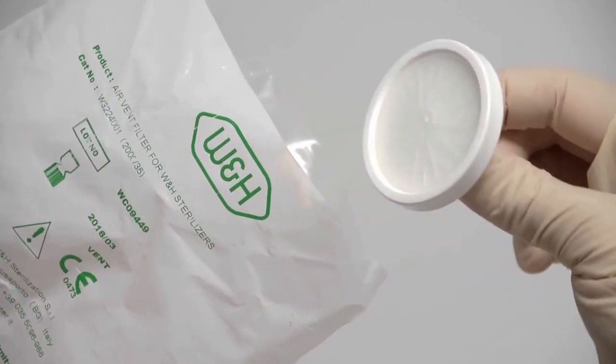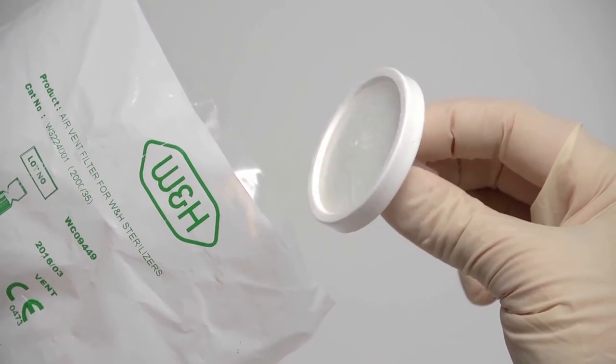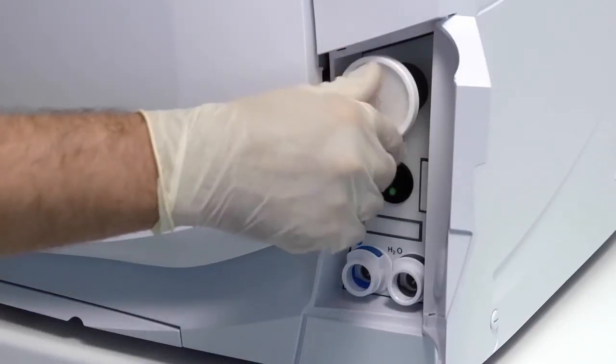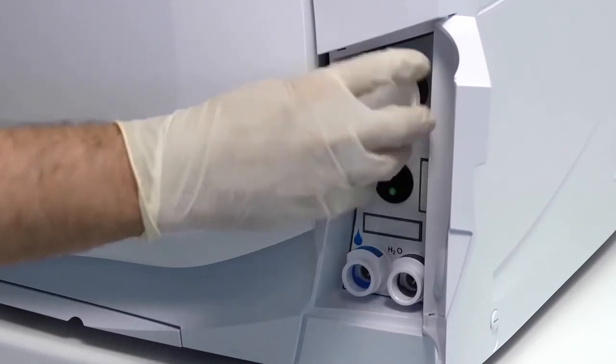A new filter can now be fitted. Remove the new filter from its packaging, insert it into the thread and rotate in a clockwise direction until it becomes tight.